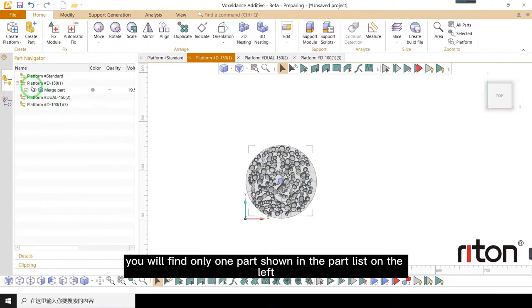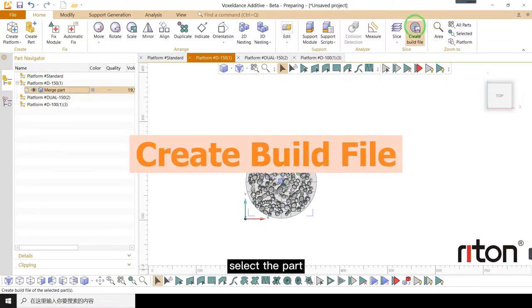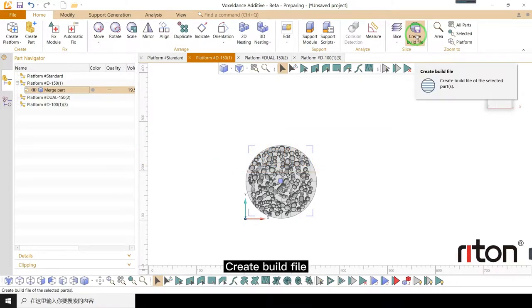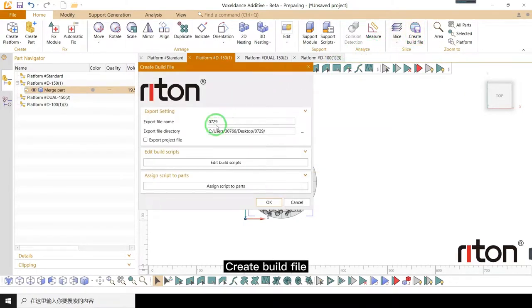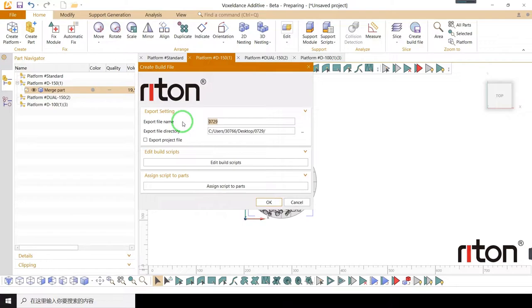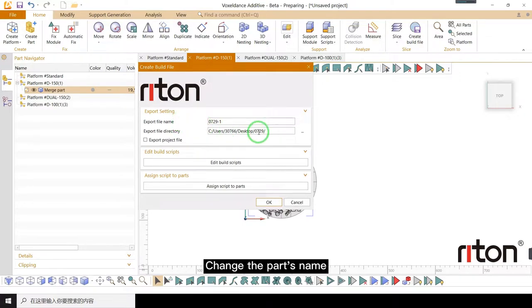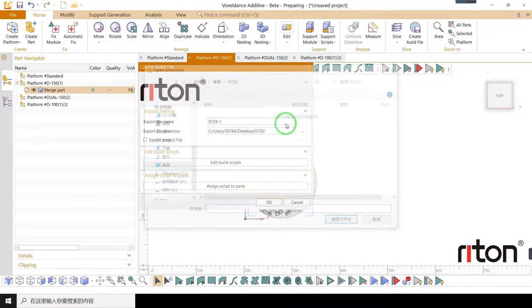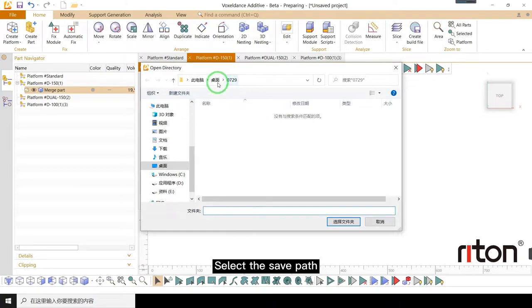You will find only one part shown in the part list on the left. Select the part, create build file. Change the parts name, select the save path.